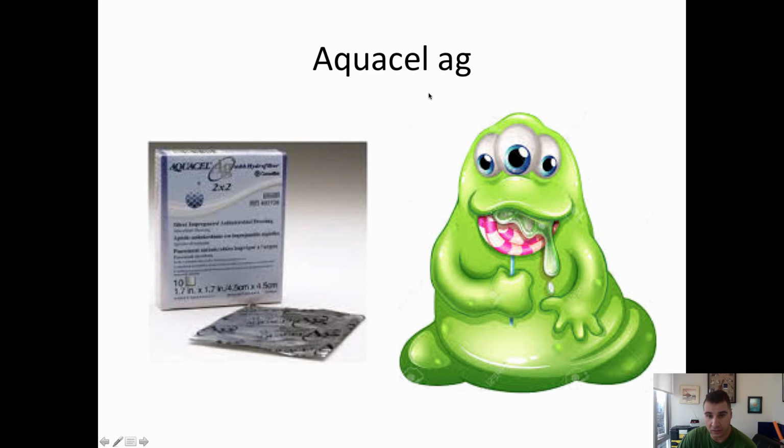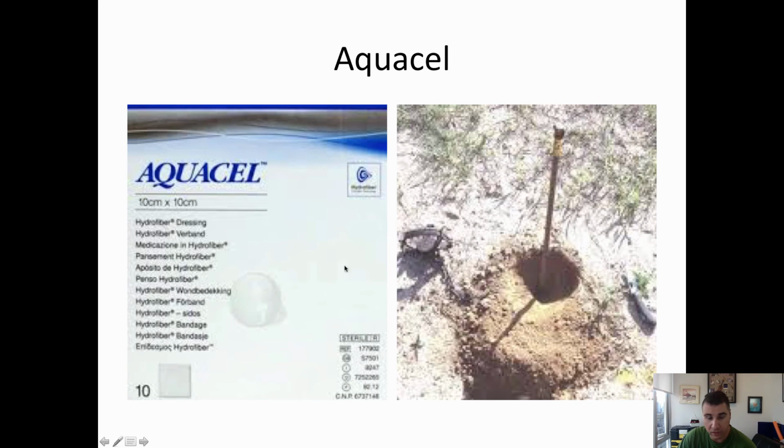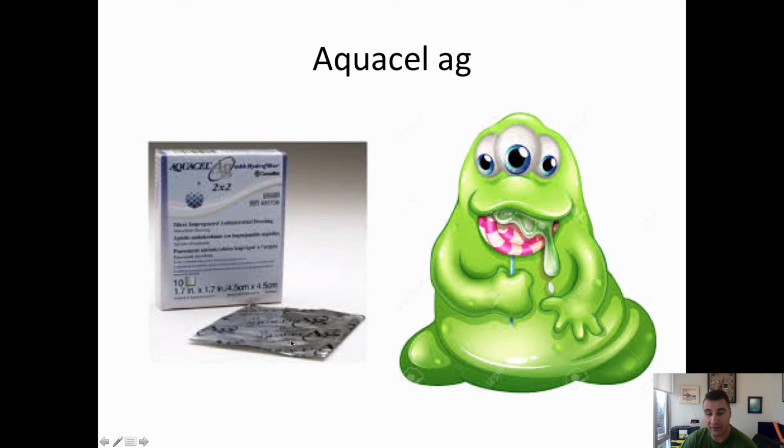The normal Aquacel still prevents a little bit of infection by kind of absorbing. It works on a different level, like I was saying. It's a little bit like a Swiffer, so the infection kind of goes up. But really, when you have an infection, so it's confirmed that there's oozing and things like that, then you want to go towards the AG.